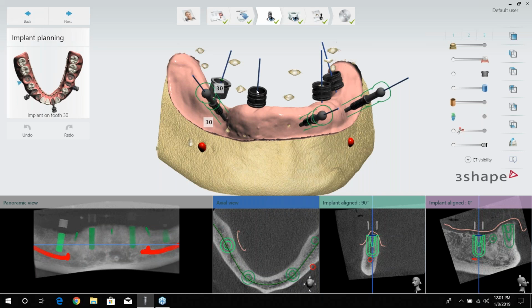Okay, next question is, does the radiopaque paint remain on the denture? If it does, does it affect the look of the denture? And what is the drying time before placing in the mouth? As far as drying time and before placing it, that would be something that the manufacturer would specify on the container.